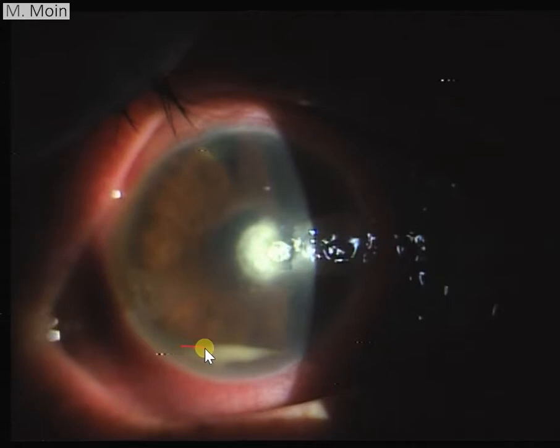So here is the hypopyon, which seems to be slightly layered. It is not producing the total level which you see in a typical hypopyon, going straight across. There can be two reasons for that. One is if the patient has been lying down and the hypopyon is very thick, the fibrin is more in that, so it might not assume that layer until a longer time. Or the other thing could be there is posterior synechiae in this area in the periphery that is not causing that hypopyon to show up clearly.